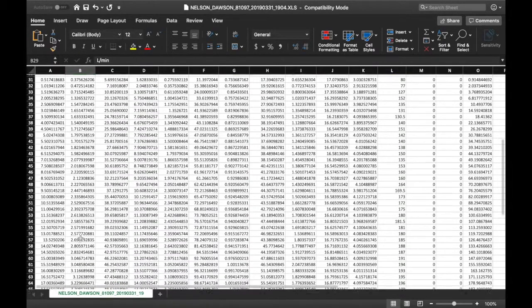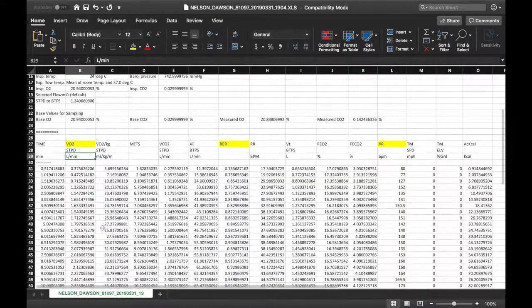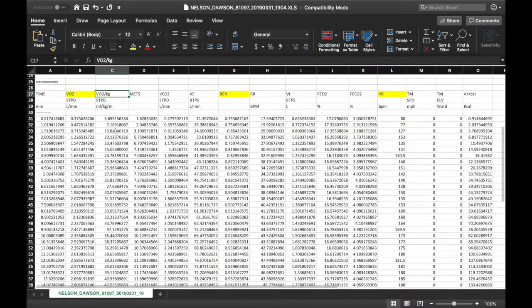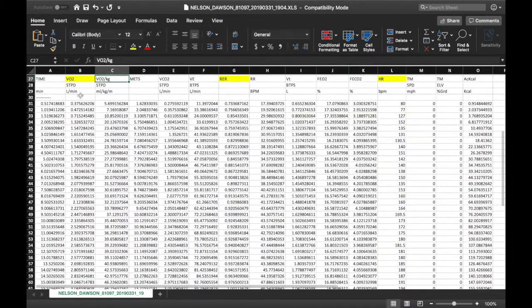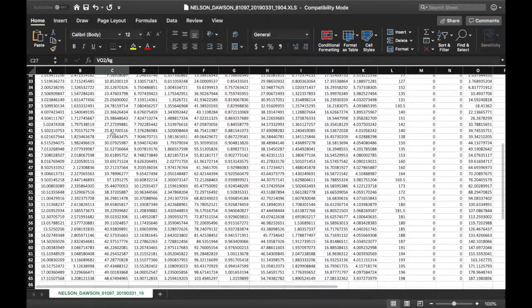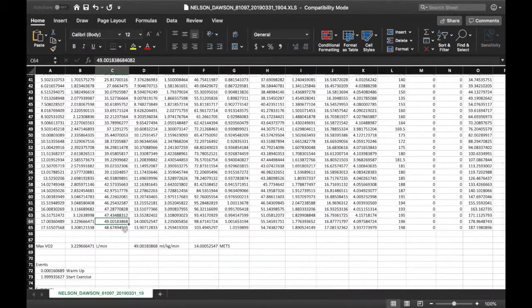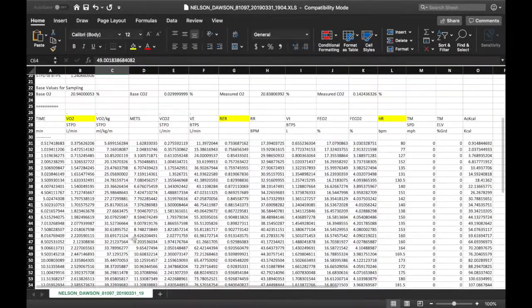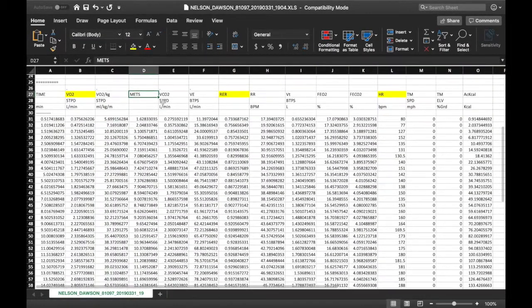The volume of oxygen consumption gets bigger as we go down, and then we've got VO2 per kilogram, which also gets bigger as we go down — and there's his VO2 max right there. So if you're simply just looking for the VO2 max, all you have to do is go right down to the bottom and it's calculated for you.